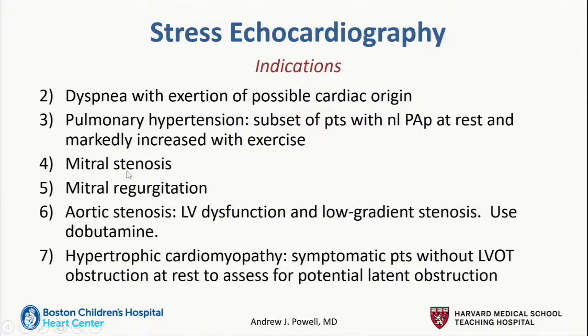Mitral valve dysfunction sometimes can become significantly worse during exercise. Aortic stenosis, if your patient has ventricular dysfunction and therefore a lower output, sometimes you can get a relatively low gradient.